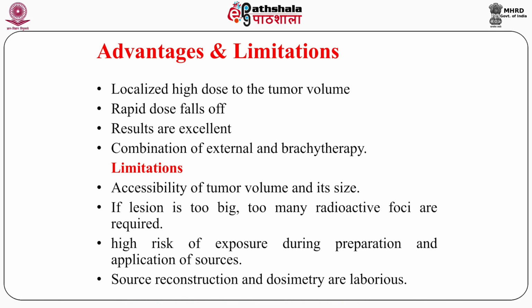So the advantage is that distant organs will get very low doses. Since we can deliver very high doses to the tumor, the results are excellent, very good. In most cases external beam therapy is also used, followed by brachytherapy.